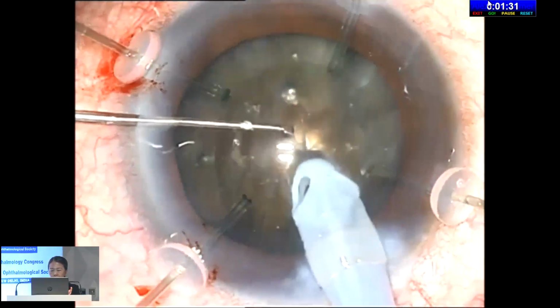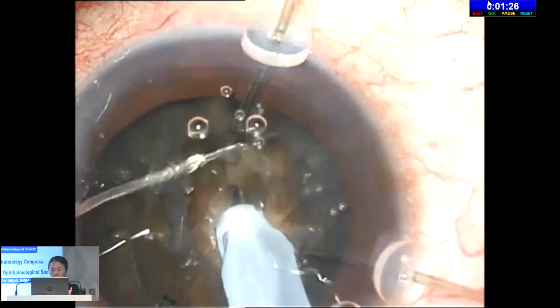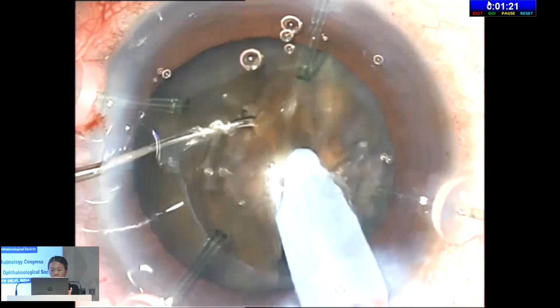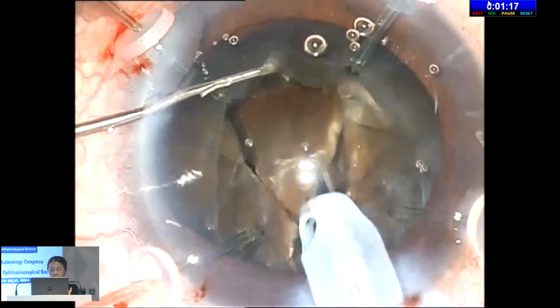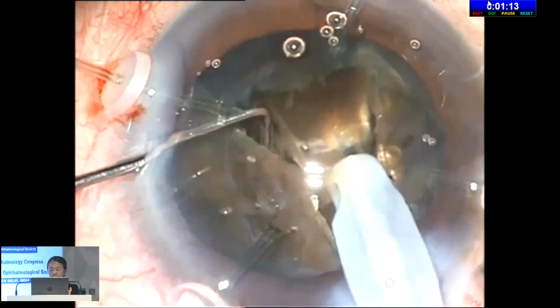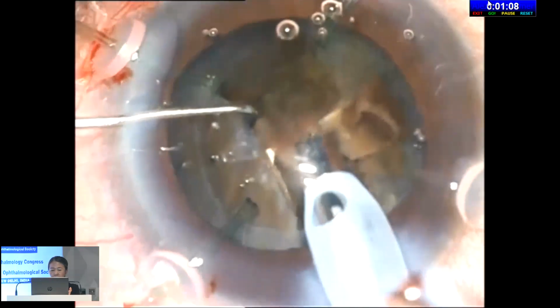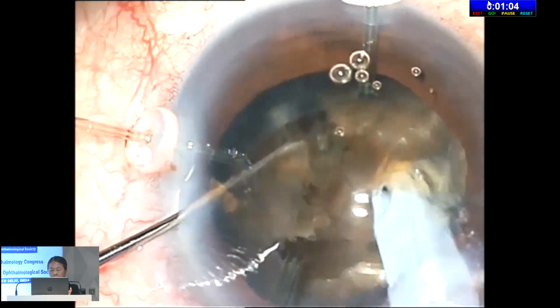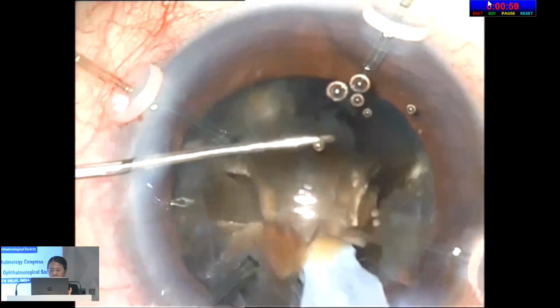I like to do 8 segments, but really with the maximum energy, a single pass. And you can see, actually, it does create a very good cut right down to the posterior plate. So you still need to do lateral separation. You don't really need to do the chop. And once you've separated it completely right down to the apex, you can tumble out the first piece, and you need to keep your phaco needle deep, so that you are away from the corneal endothelium. And as mentioned, from time to time, you need to top up the dispersive viscoelastic.